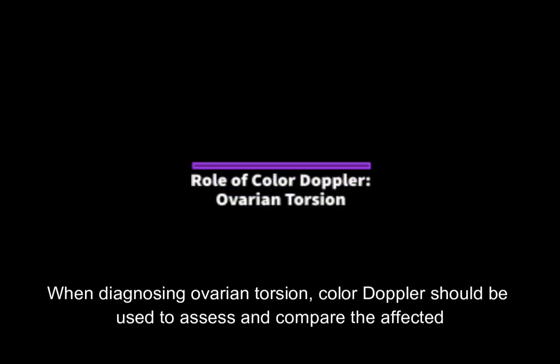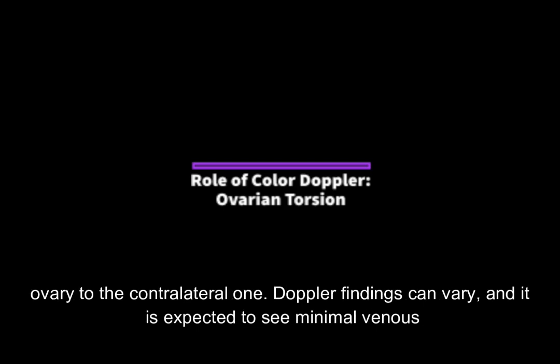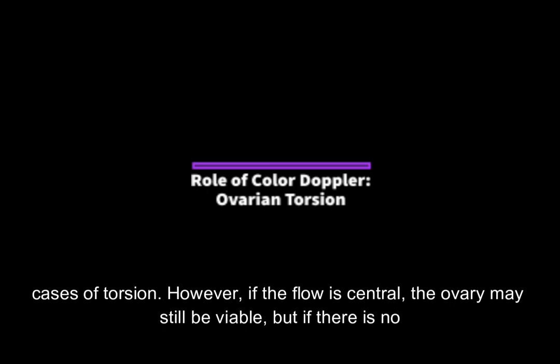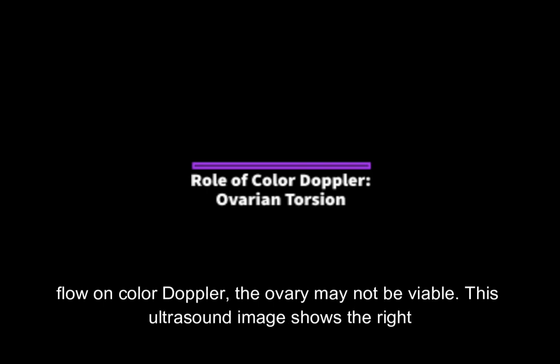When diagnosing ovarian torsion, color Doppler should be used to assess and compare the affected ovary to the contralateral one. Doppler findings can vary, and it is expected to see minimal venous flow. Due to the dual blood supply of the ovaries, normal arterial flow can still be observed in cases of torsion. However, if the flow is central, the ovary may still be viable, but if there is no flow on color Doppler, the ovary may not be viable.